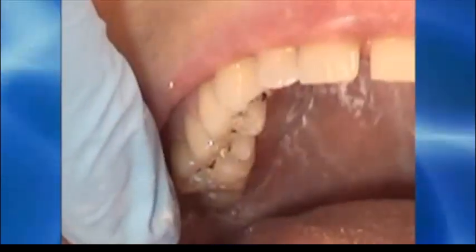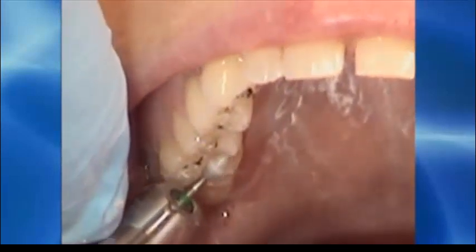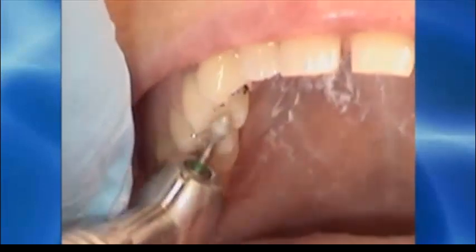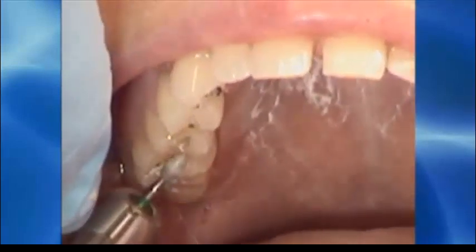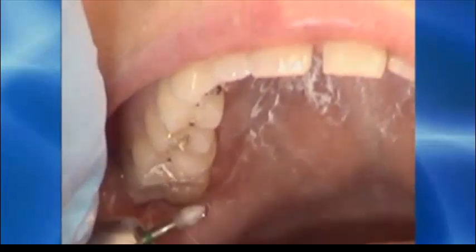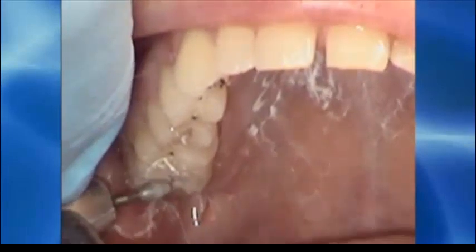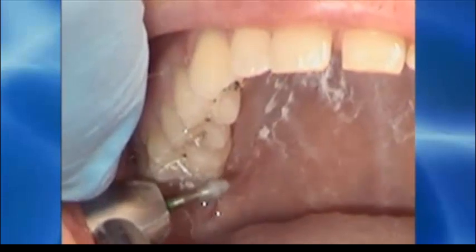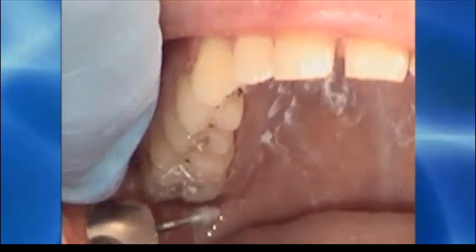On the opposing upper right side, here you see contact in the central fossa on most of the teeth, and slight contact, scratchy little lines, and inconsistent contacts all around the contacts that are desirable in the central fossa on the marginal ridge. A good example is here on the buccal aspect of the first molar. I'm leaving the contact in the marginal ridge area, but treating the buccal aspect of the first molar, and doing the same thing here on the buccal aspect of the upper second molar. Also refining a little bit on the lingual, just gently touching the teeth, removing any of the lace-like contacts.